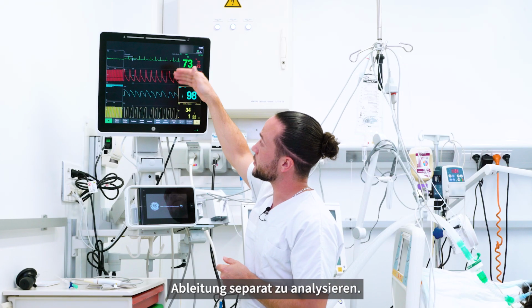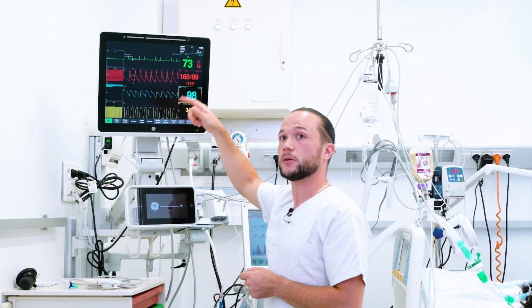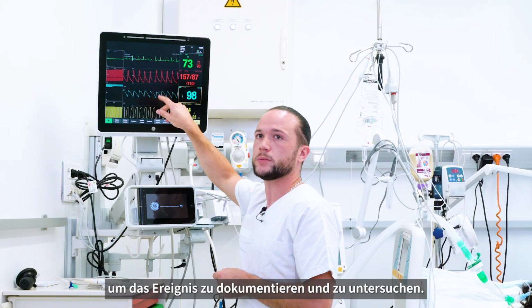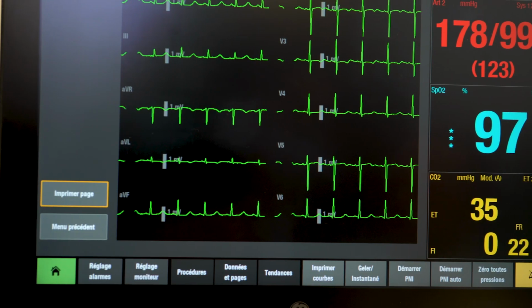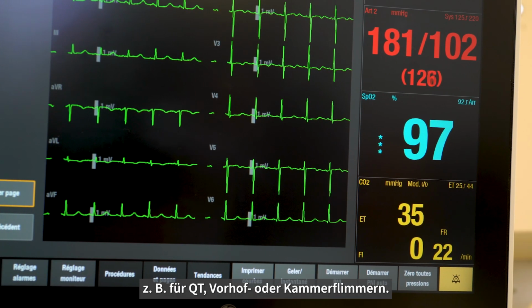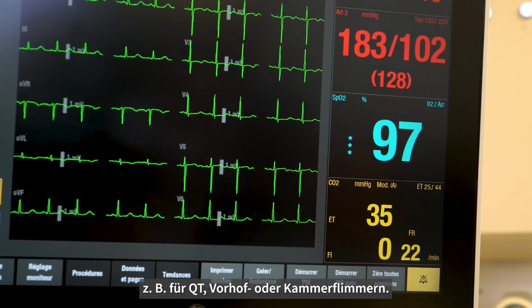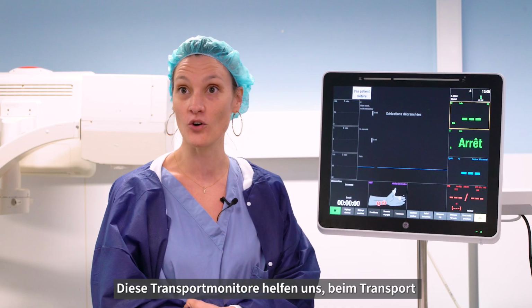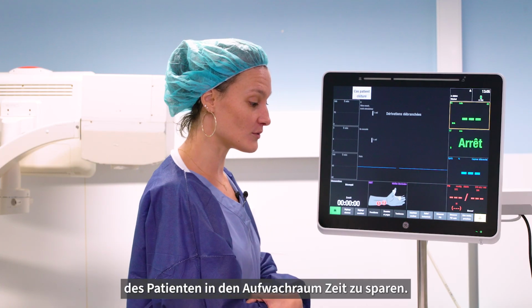This also allows us to analyze each ECG signal independently. In the event of an anomaly, a screenshot can be taken to document and review the event. When monitoring the 12 signals, different alarms can be set for each signal, whether on the QT parameter or on atrial and ventricular fibrillation. With these mobile monitors, we save time when transporting the patients to the recovery room.